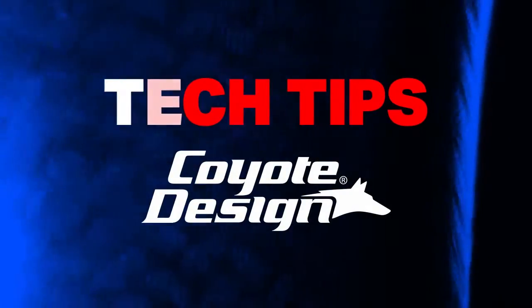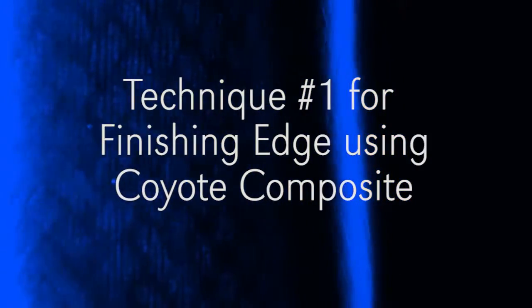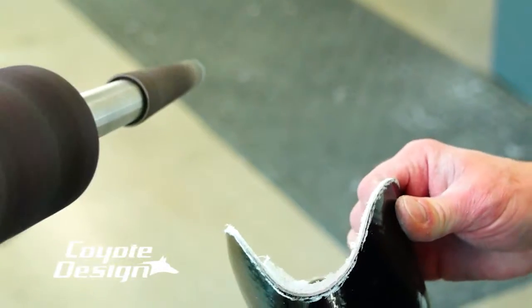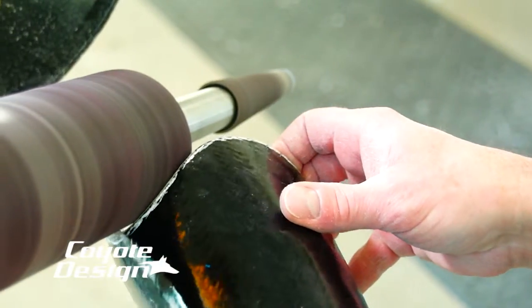Tech Tips from Coyote Design. What I've got on here is a rough to a medium rough cone — that's how I start my edges.